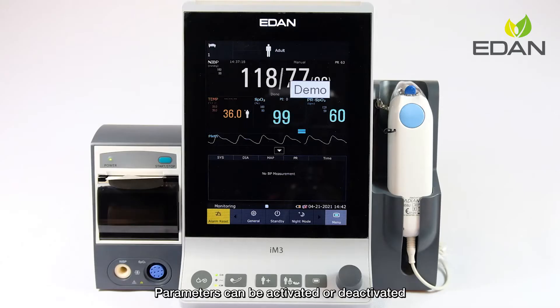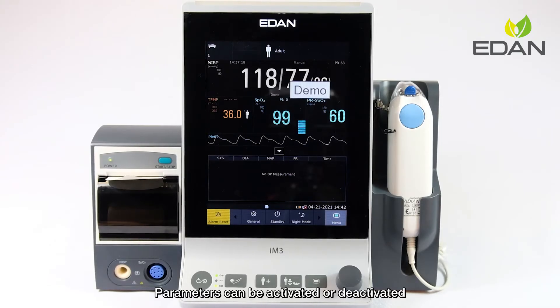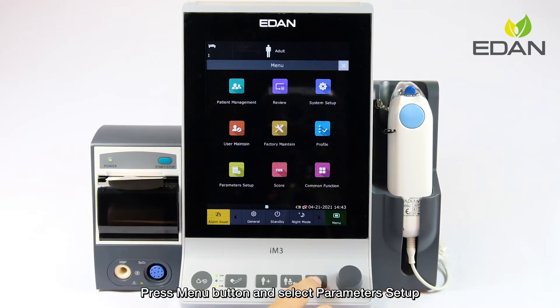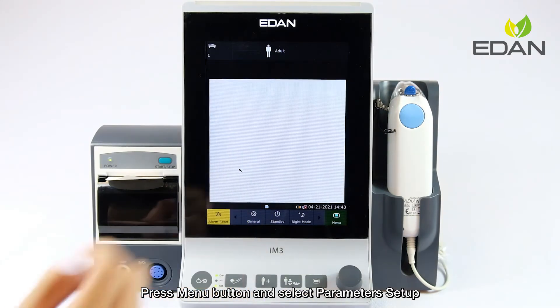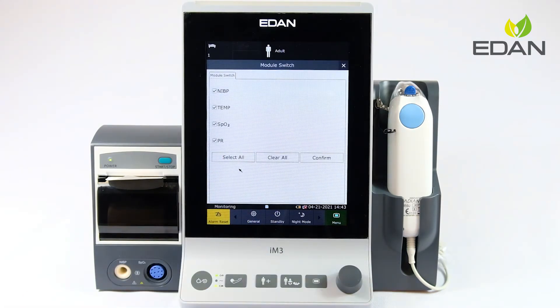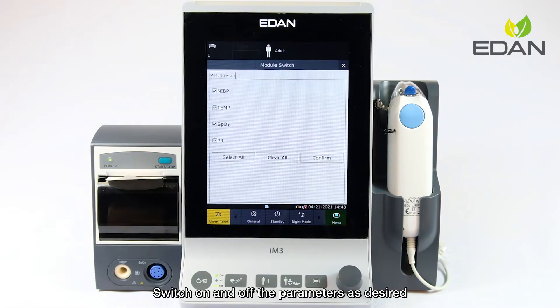Parameters can be activated or deactivated. Press the menu button and select parameters setup, then switch the parameters on or off as desired.